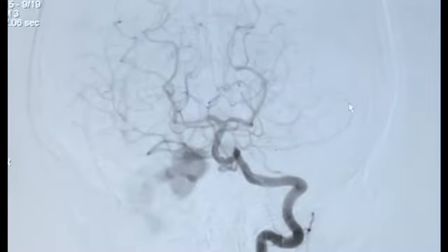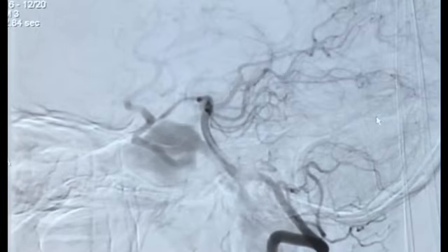With such patients, we should do a cross compression study, and this cross compression study is done with compression on the same side of the fistula with the injection from the other carotid and vertebral artery, basically to look into the cross flow as well as the site of the fistula. Here we are trying to locate the site of the fistula. This is the lateral vertebral injection, which is showing us the site of the fistula.